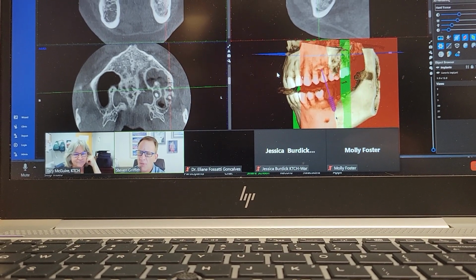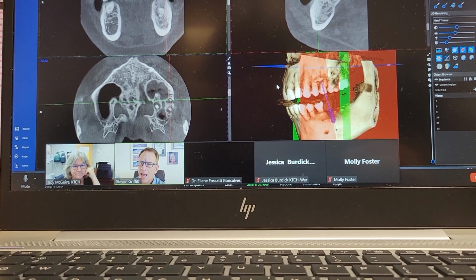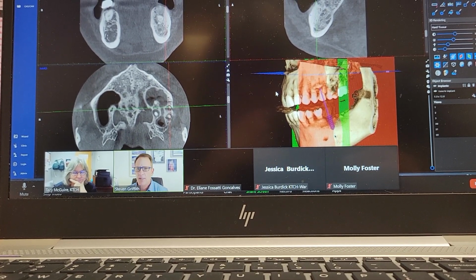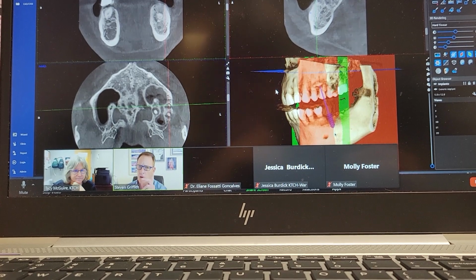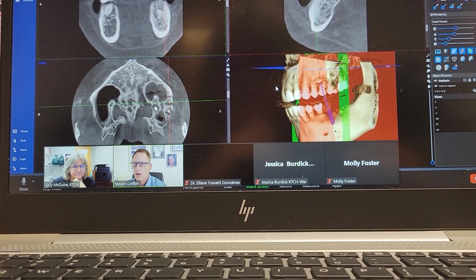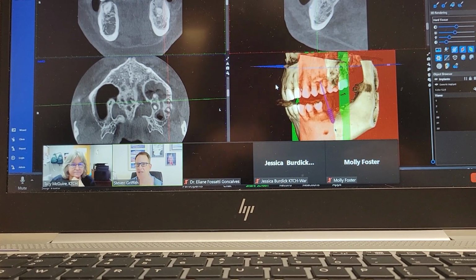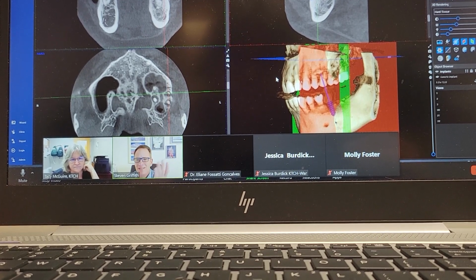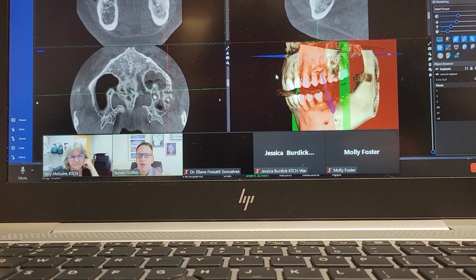But after I've gone through a few of them with you, you'll spot that one staff member who constantly gets them lurched forward, or on the 2D, they're constantly cutting off the front teeth, or whatever it is, right? So send me some of the images and just say, hey, what do you think? What is the problem here? Because images tell me everything. I can tell you typically what you're doing right and wrong right off the bat.